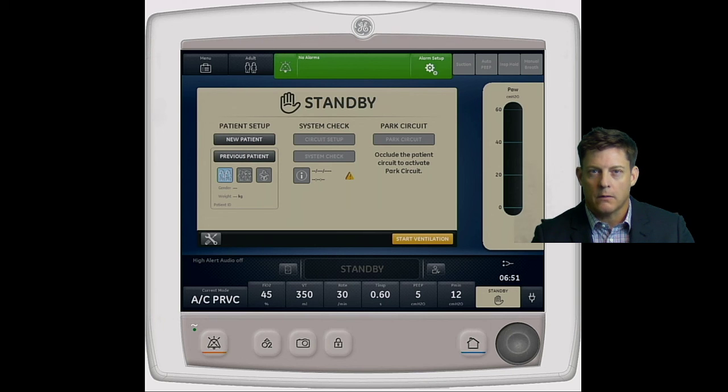The simulator itself took approximately 100 pictures to get it made and close to 200 hyperlinks to build. So adding setting changes and everything like that is quite an extensive project. I'm just going to overview how it works. We wanted to deal with navigation because when we get into the views, there's over 14 different views with the display views, so this can be kind of cumbersome to someone who's first learning this ventilator.